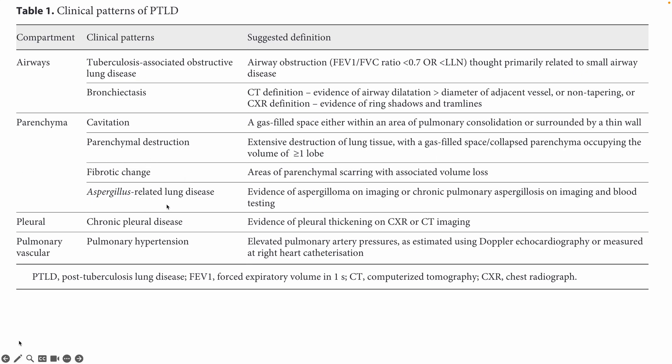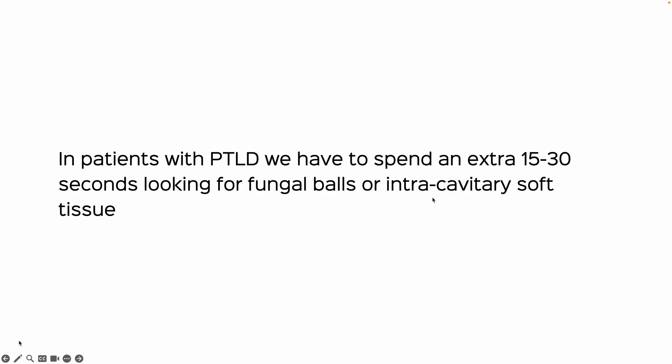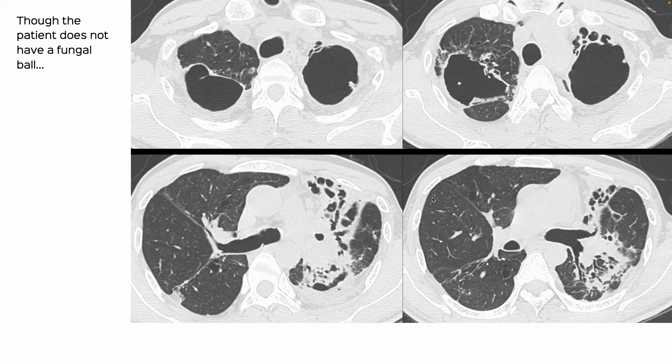One of the things — and you can see it here — is to also look for aspergillus-related lung disease, to look for fungal balls or chronic pulmonary aspergillosis. In patients with PTLD who have cavities, we as radiologists have to spend an extra 15 to 30 seconds looking for fungal balls or intracavitary soft tissue.